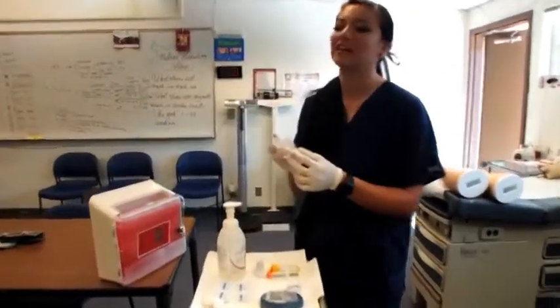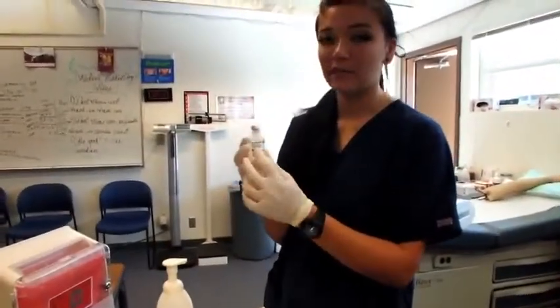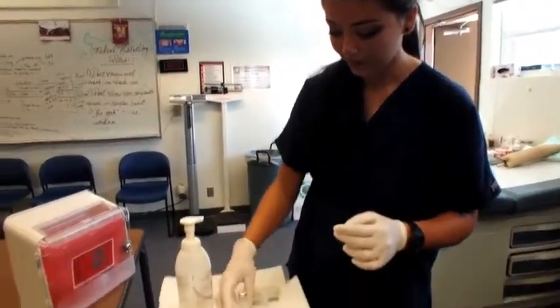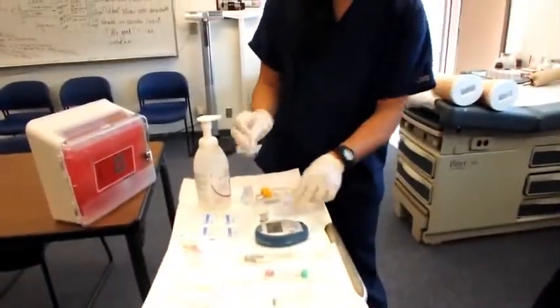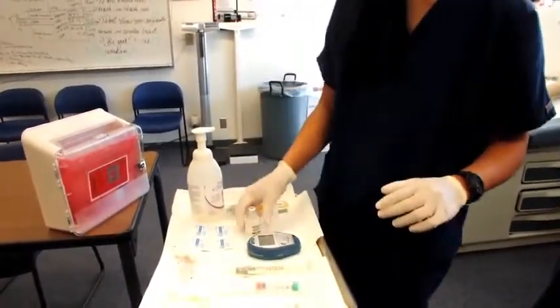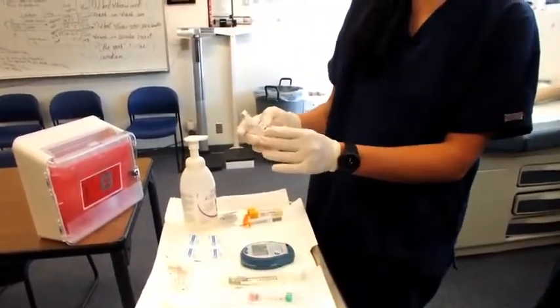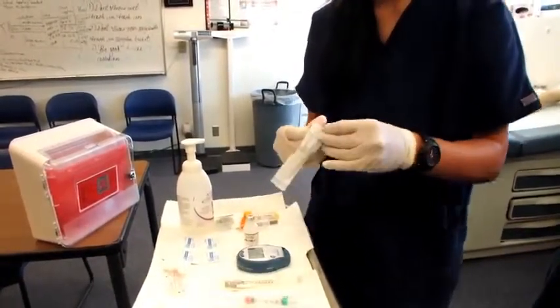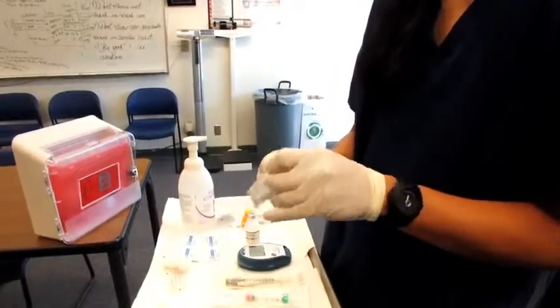I'm taking the medication out of the cabinet. I'm going to make sure that it's the right medication, the right dosage, and the expiration date. Alright, and then I'm going to wipe off the top of this to clear it of any debris. And before I draw it up, I'm going to check again the right medication, the right dosage, and the expiration date. I'm going to put my needle on my syringe.